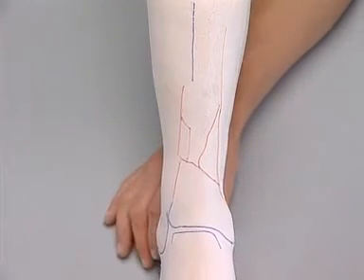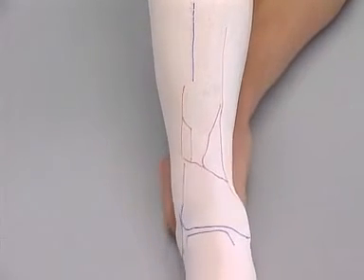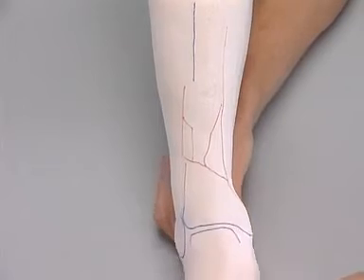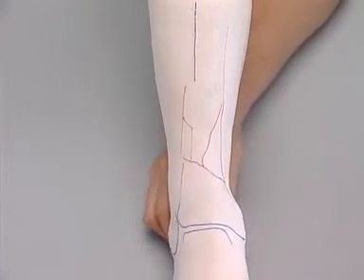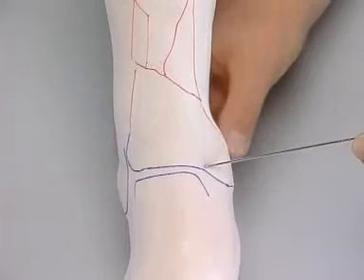Instability is clearly visible in the fracture model. For this exercise, the reduction is checked visually, but in reality, this has to be done through image intensification. Marking of the upper ankle with a K-wire.